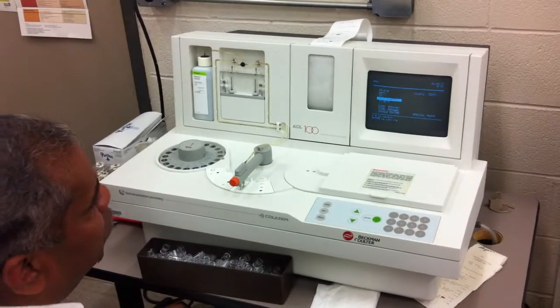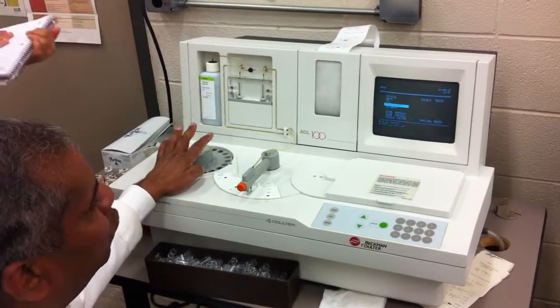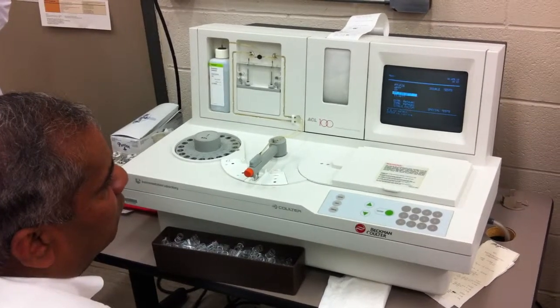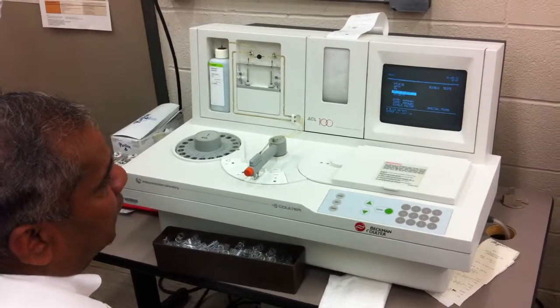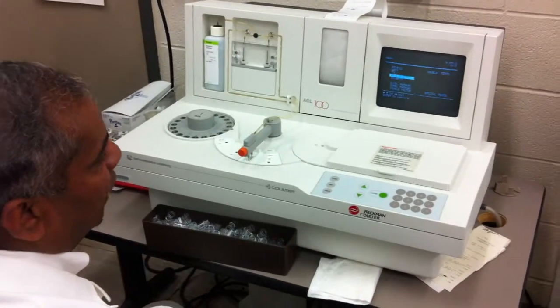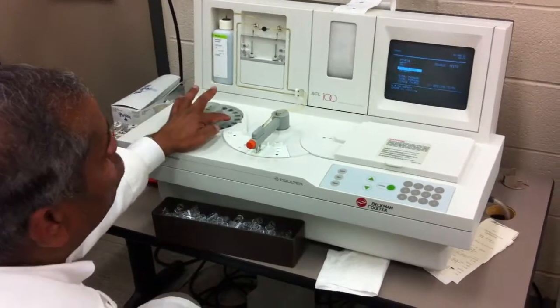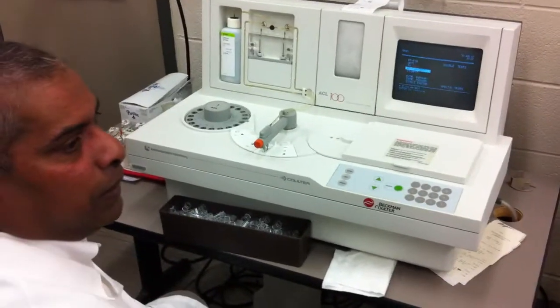So you can do a PT fibrinogen. You'll need to have the pool in here, right? Whenever you're asking for fibrinogen, you gotta put the pool because it recognizes automatically that you need fibrinogen. You can just do a PT. TT is thrombin time. That's not routine. So the one that's highlighted is for PT, fibrinogen, and aPTT. That's the one we usually select. If you want the fibrinogen, you put the pool. If you don't put the pool, it's not going to give you the fibrinogen. It's just going to give you PT and PTT.